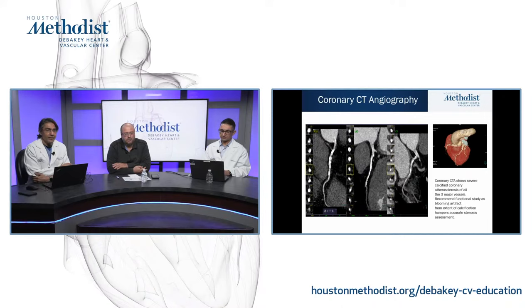Exactly. So in this case, a lot of labs don't necessarily have FFR. There's a lot to be learned with FFR and severe calcification, CT-FFR. This is a good example where you started off with one test and needed to layer tests in order to get your answer. Exactly, yeah. Thank you, Dr. Nabi.